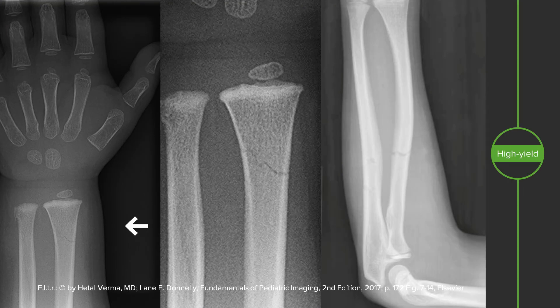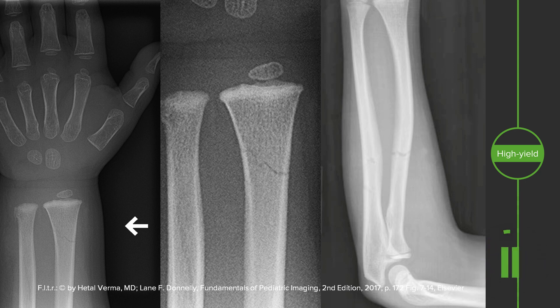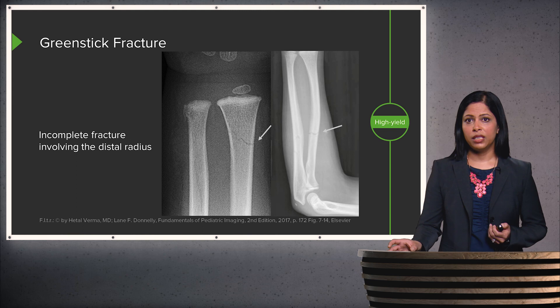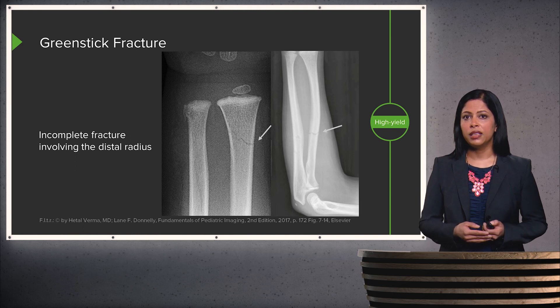Here we have two images of the wrist and a single image of the forearm. On this coned-down image of the distal radius, we can see a very subtle fracture line that involves a portion of the cortex — it comes partway through, but the other portion of the cortex is not really involved. We see a similar fracture of the radius on the other view. This is an example of a greenstick or incomplete fracture of the distal radius, involving only one side of the cortex, very commonly seen in immature bones.